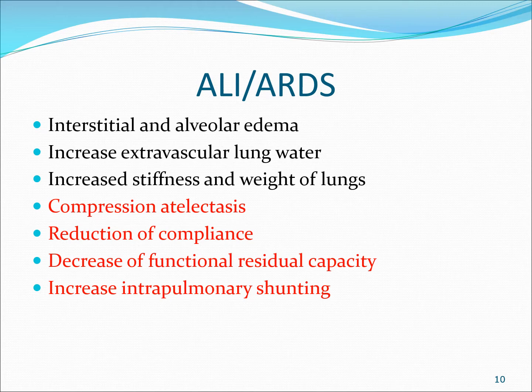As a result of that, you end up getting what is commonly called compression atelectasis. All that fluid and the heaviness of that fluid pushes down on the alveoli, and then the alveoli become collapsed, and that's compression atelectasis. You're also going to see a reduction in compliance. You're going to look at your compliance on the ventilator.